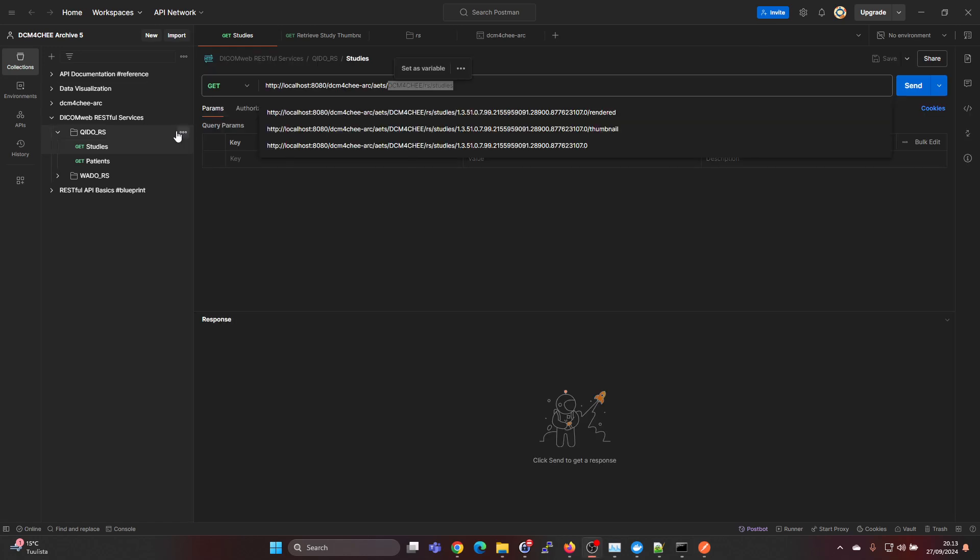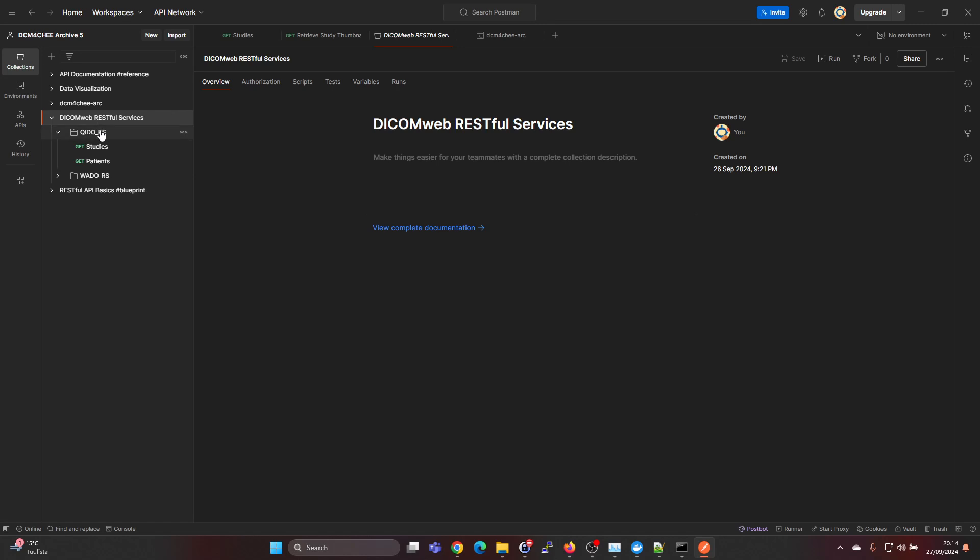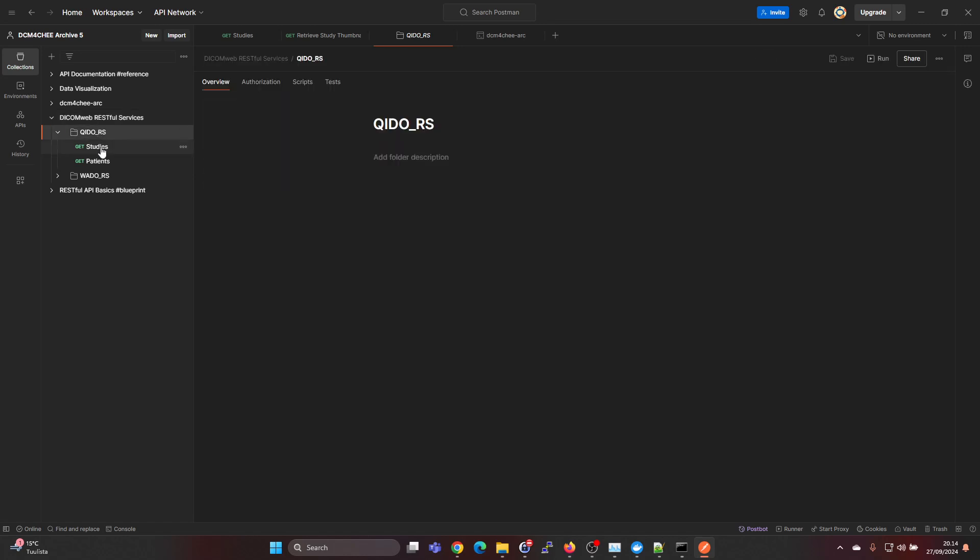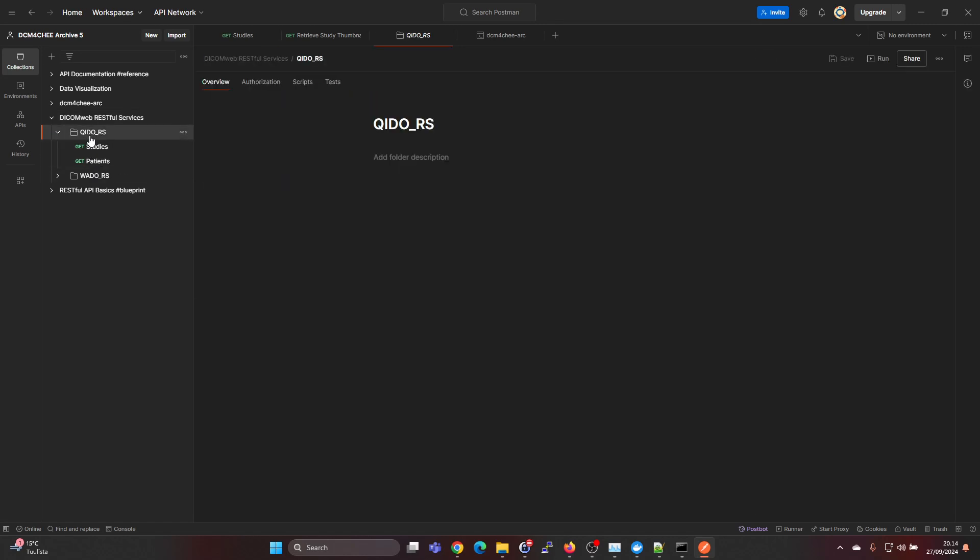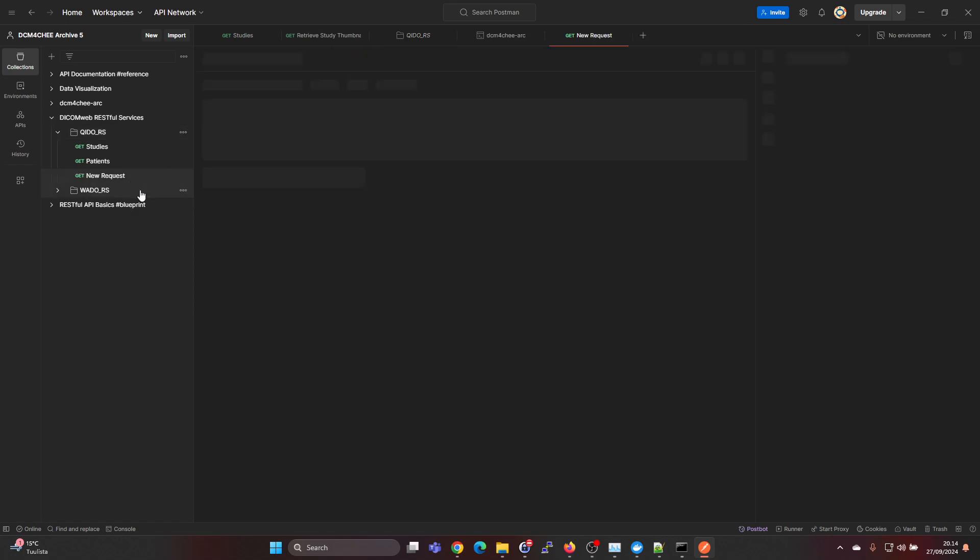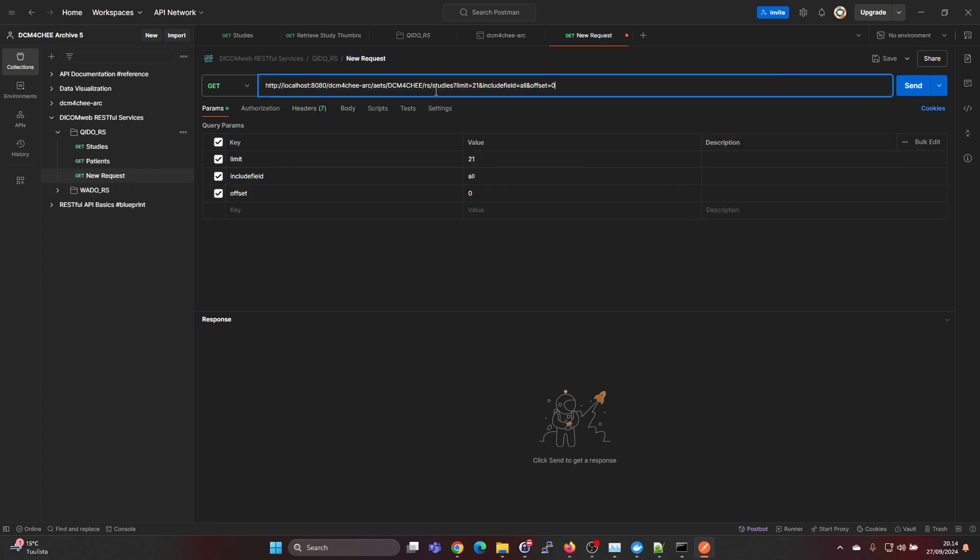I already have made a new project here with a few queries. We can go ahead and add a new one. Add request here and then we can copy paste this URL.